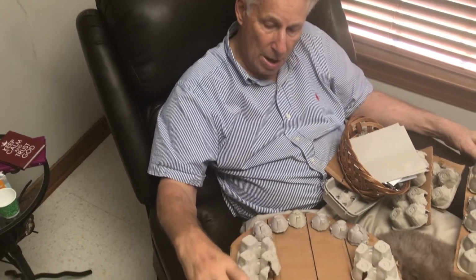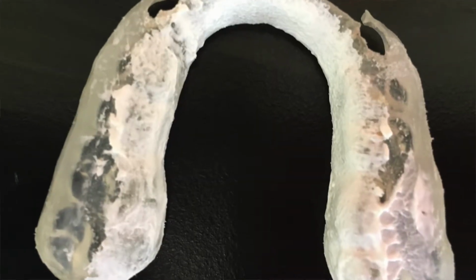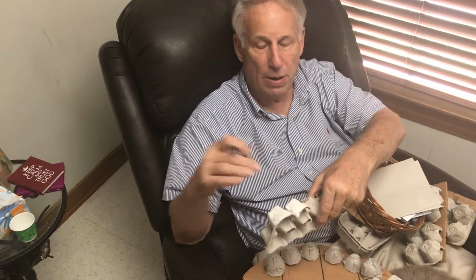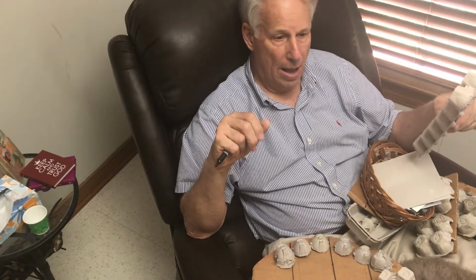So we take our appliance, and we cover it with PIP, and then we have them say Mississippi, 66, Church, Lucky Lucy, Lady Liberty, 33. And then we give them a cup of water, and we have them take the water in their mouth, set it back, and look straight ahead and swallow it. That's kind of a forced swallow instead of cheating. They have to hold their head correct.